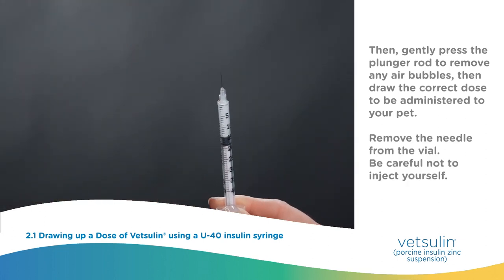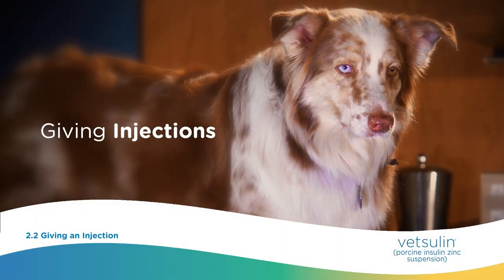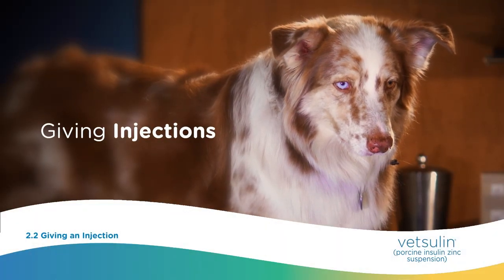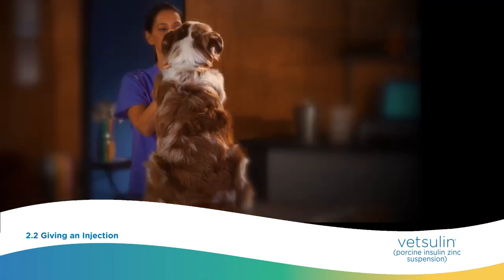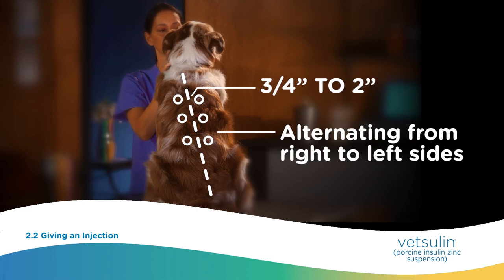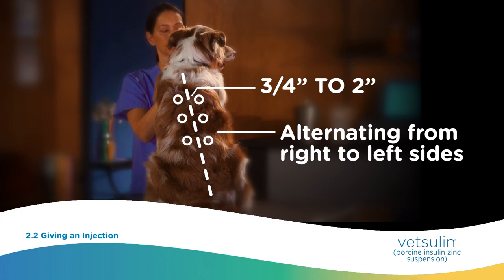Be careful not to inject yourself. Giving injections may seem daunting, but with practice, it can be easy and fit into your daily routine. Injections should be given just under the skin, three quarters to two inches from the dorsal midline (spine), varying from behind the scapula (shoulder) to the mid-lumbar, mid-back region, alternating from right to left sides.